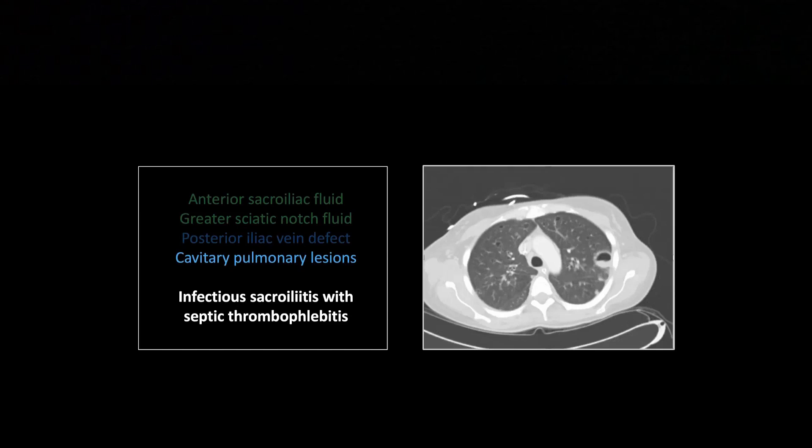We have peripheral subpleural cavitations — the classic finding of septic emboli. When you see bilateral cavities up against fissures and pleural surfaces, definitely start thinking septic embolization. They're not all going to be peripheral — that's not an absolute rule — but I like to see at least one or two notably peripheral before I really come down hard on it.